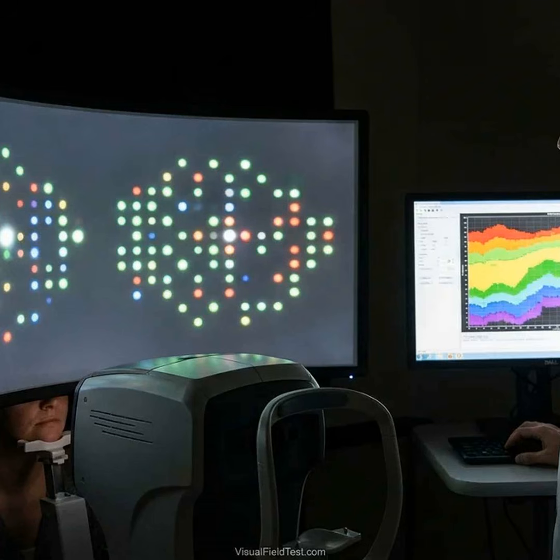One classic study found that a subset of early glaucoma eyes had larger losses for red-green color contrast than for white-on-white vision. This suggests that parvocellular LM cone ganglion cells can be selectively damaged. In that study, red-green contrast thresholds in some patients were unexpectedly worse than predicted by overall sensitivity, implying a departure from the usual assumption that large magnocellular fibers would show equal or greater loss.